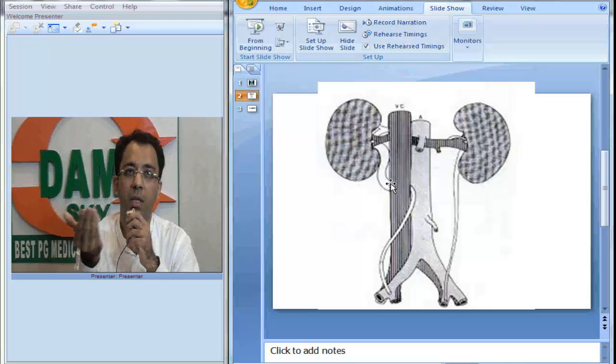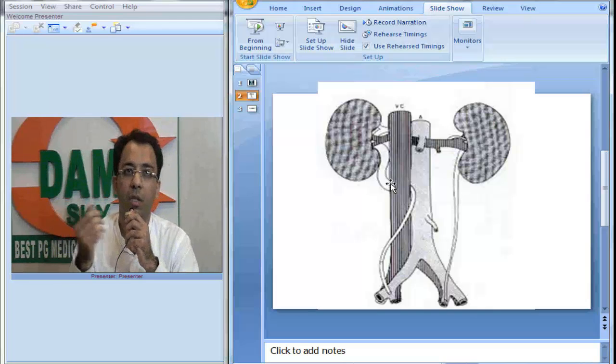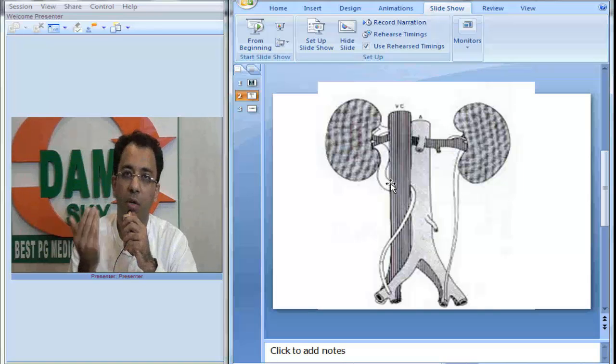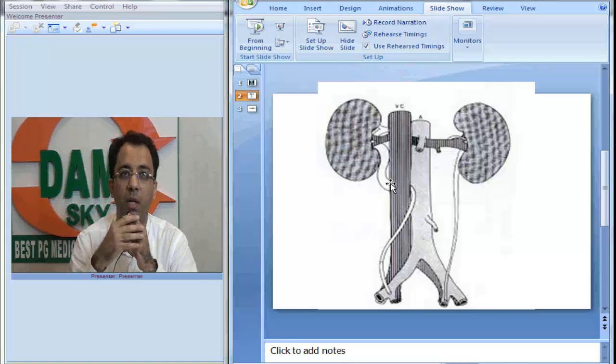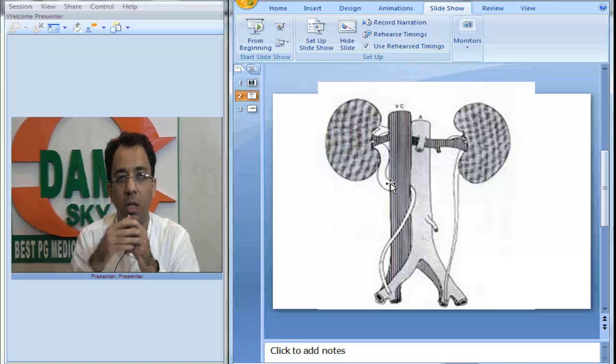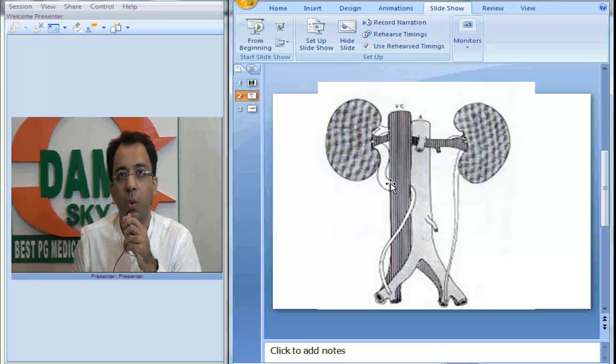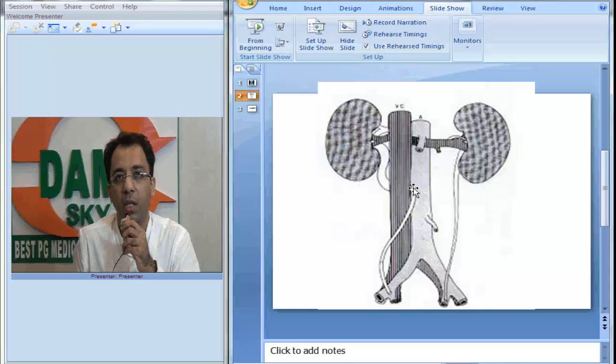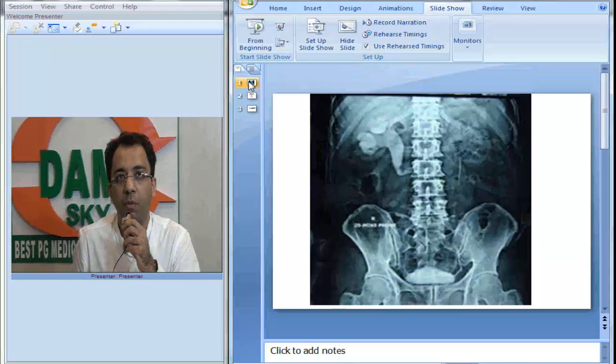If we see the ureter passing behind the inferior vena cava, this can be confirmed on CT urography as well. On IVP films we see medial deviation approximately at the level of L3. This is a classical retrocaval or circumcaval ureter. Thank you.